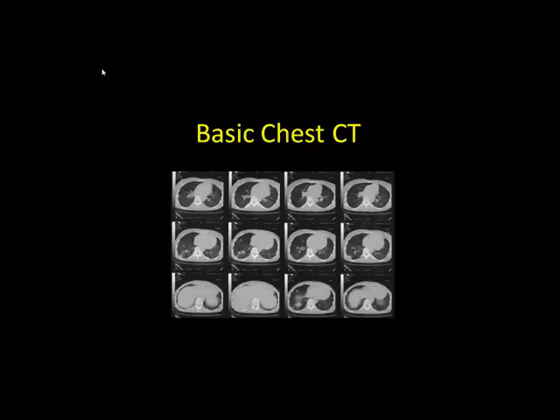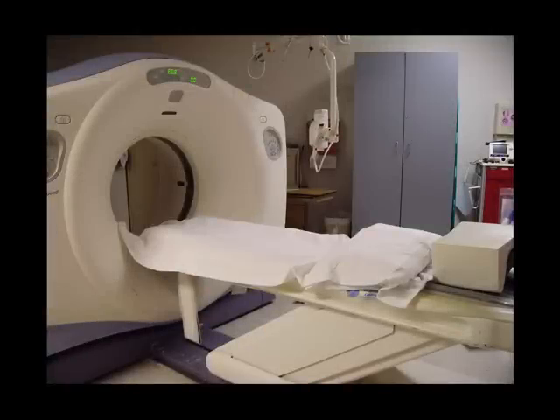Hi, today's lesson is on the basic chest CT, and we're also going to be discussing abdomen and pelvis CT too. So one of the first things that you want to do is set your room up, and it's going to look something like this. You have a sheet on the table, you have a pillow, and your patient's going to be going in feet first.